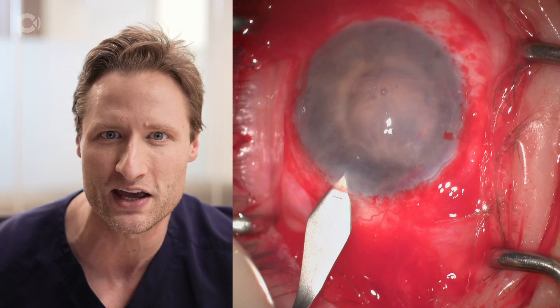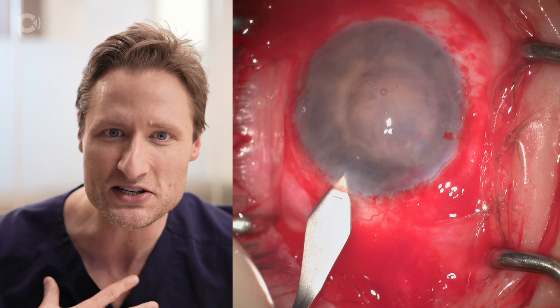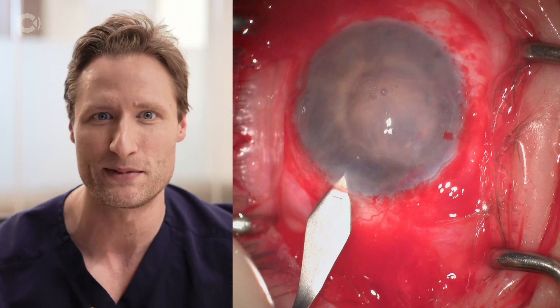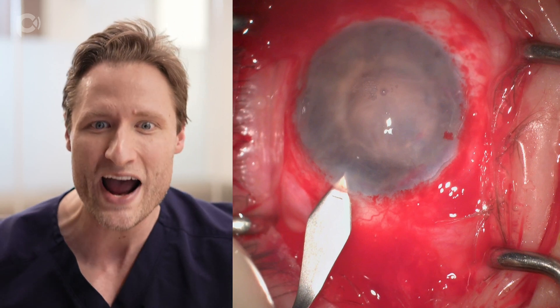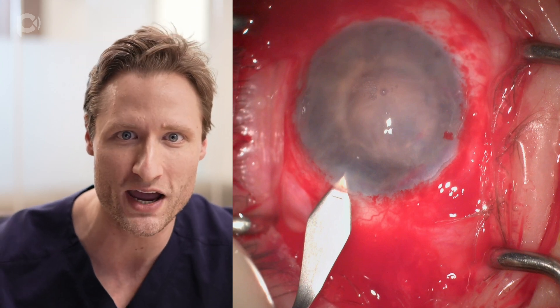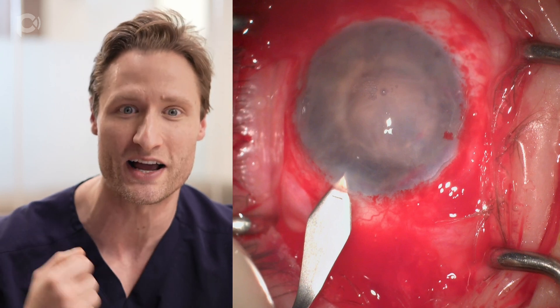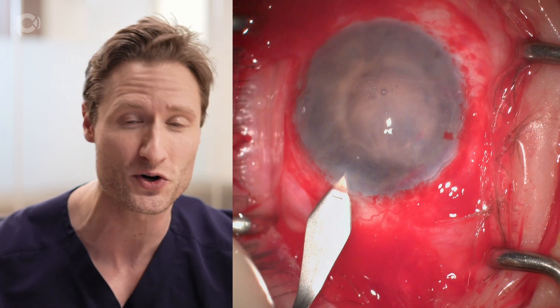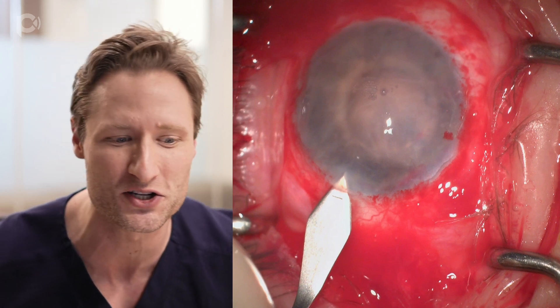Before we inject the graft, I'm making a second main incision, this time to my left with my left hand. The reason is that I'm primarily a left-handed surgeon, and I think this is going to be a difficult operation. Rather than trying to finagle various unfolding techniques with my right hand through a main wound on my right, I prefer to have access by my dominant left hand. Contrary to what many people do with DMEK — trying to avoid using the main wound or suturing it — I am such a fan of using the main wound that I'll make a second one where I can use it with my dominant hand.